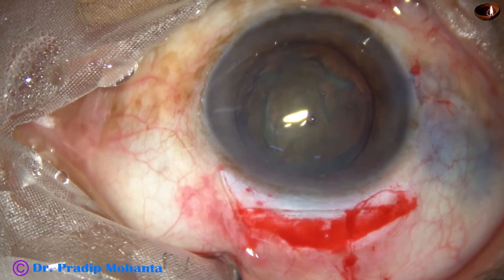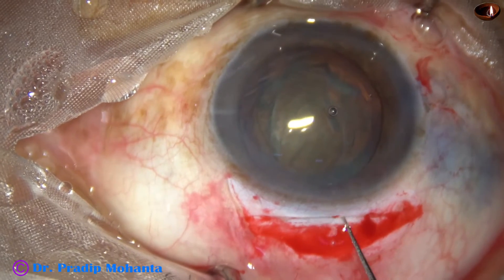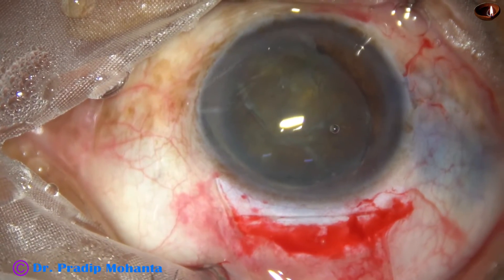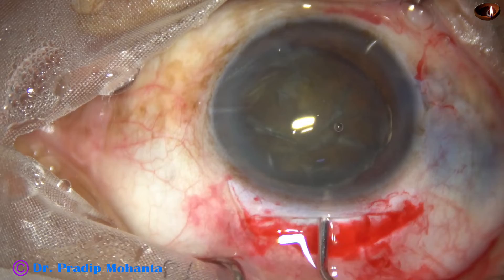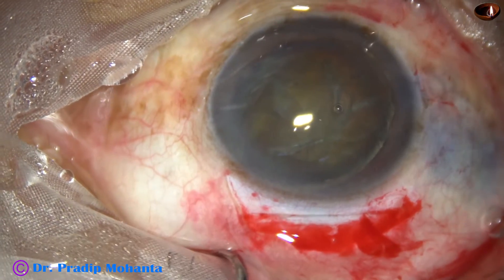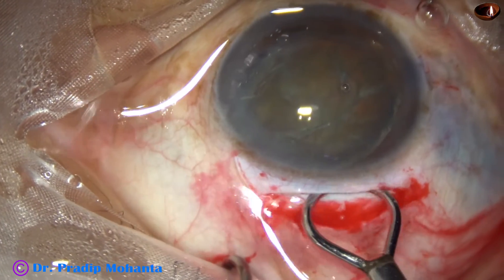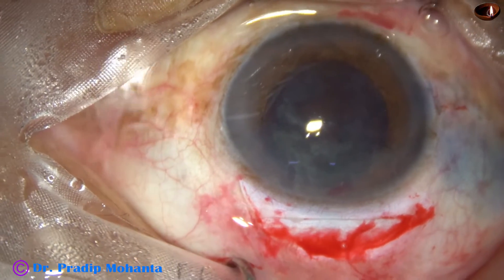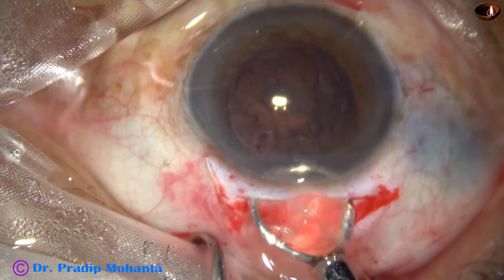The anterior chamber is filled up with two percent hydroxypropyl methylcellulose. A Sinskey hook is taken, the nucleus is dialed and prolapsed out of the capsular bag. Viscoelastic is applied between the corneal endothelium and the lens mass, and also behind the lens mass. An irrigating vectis goes behind the lens mass and the nucleus is gently delivered. The irrigating vectis is then used to remove some additional epinuclear material.